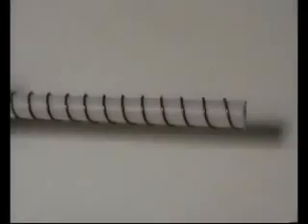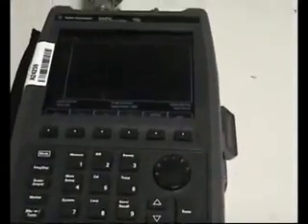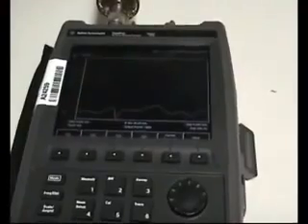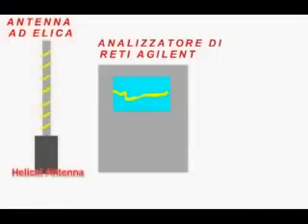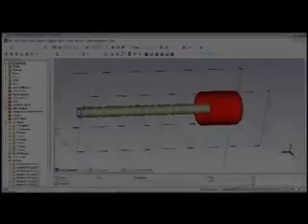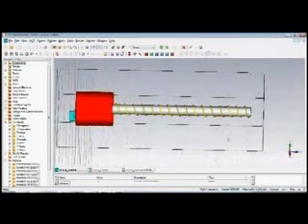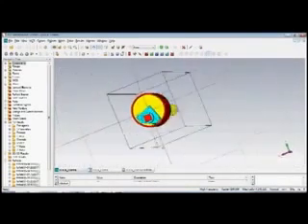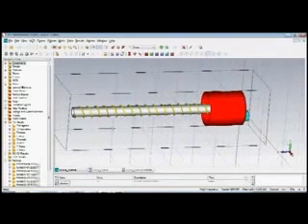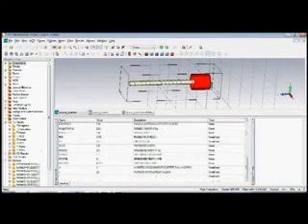The system developed is of course a laboratory prototype, used uniquely to demonstrate the potential of the technique proposed. It consists of an antenna, a vector analyzer, and a PC. The radiating system is a helical antenna specifically designed and built for this study. At present, it represents the best trade-off among conflicting constraints of portability, light weight, small size, and electromagnetic working conditions.